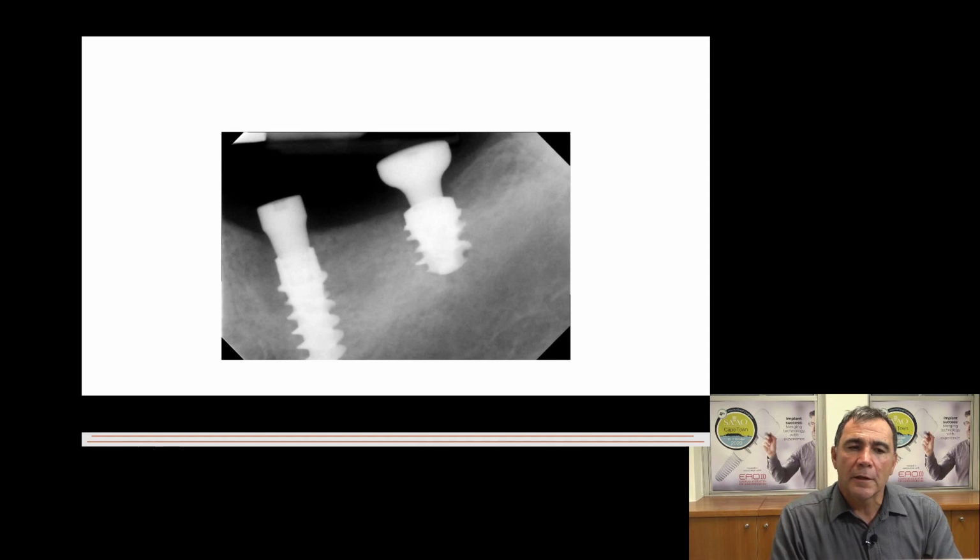And this is the actual case at completion of the placement of the implants. We are now just over halfway with this treatment plan. And if you had looked at this X-ray before you had seen the CBCT, you would surely have criticized me for using such a short implant in the posterior. But as I proved to you, that is the longest implant that I could get in that situation.